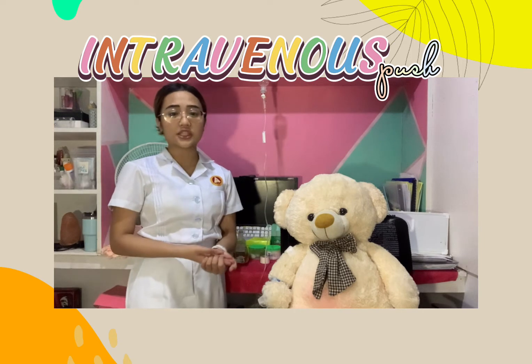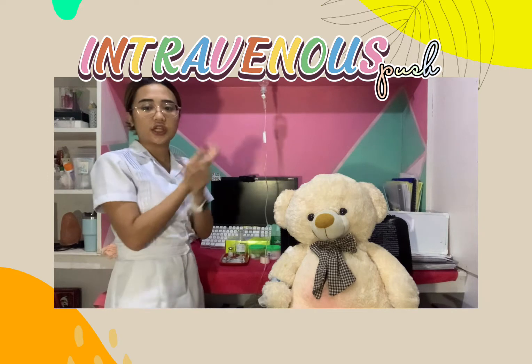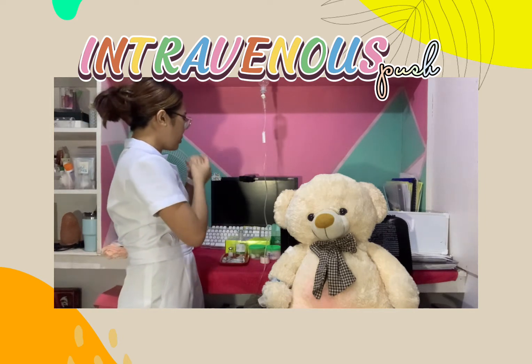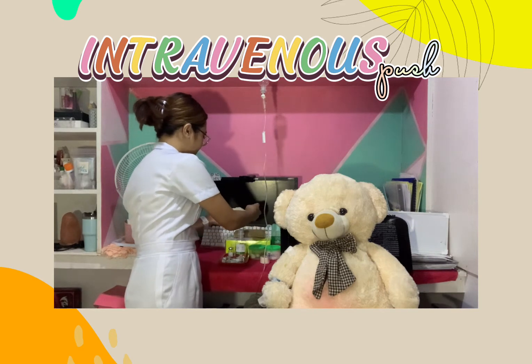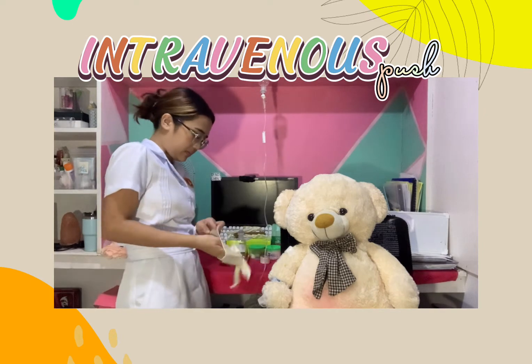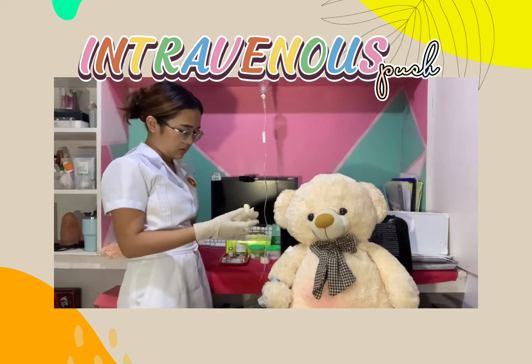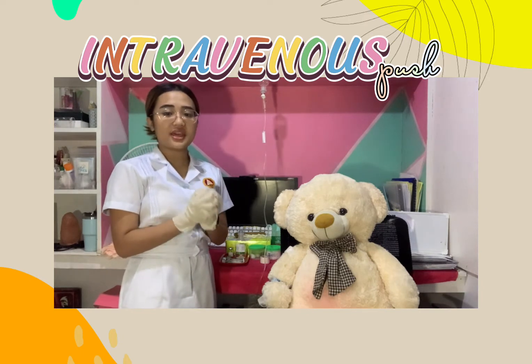For the implementation, first we need to perform hand hygiene technique or any infection control technique. I've already done hand washing, so now we can just disinfect our hands, and then we can put on our sterile gloves or our clean gloves. After that, we can now prepare the medication.